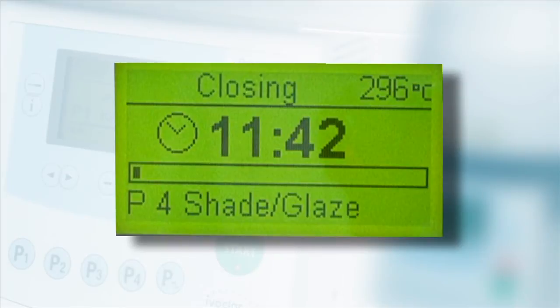Once a program has been started, the status area will display the program status along with the current temperature. The main area displays the remaining firing time along with the representative bar graph. The currently selected program number and name are displayed at the bottom of the screen.